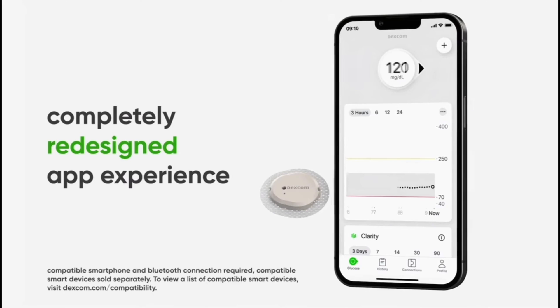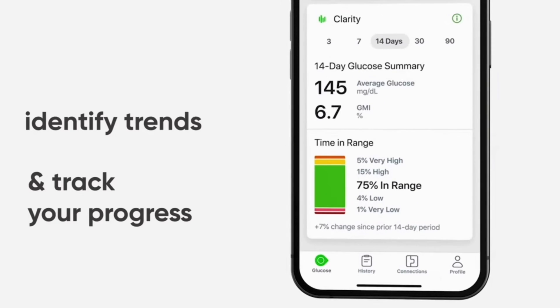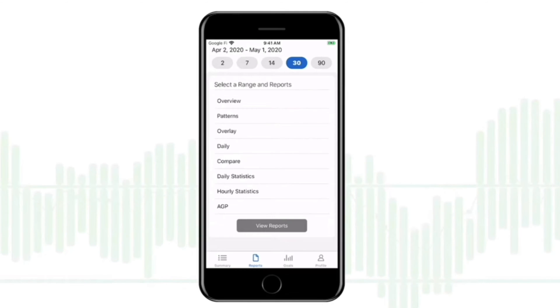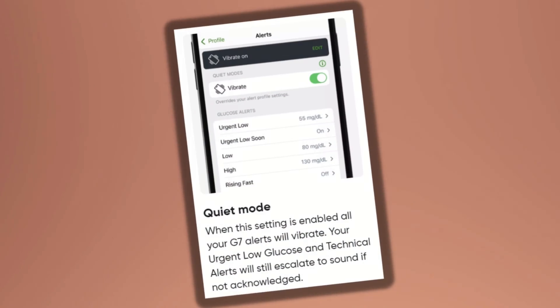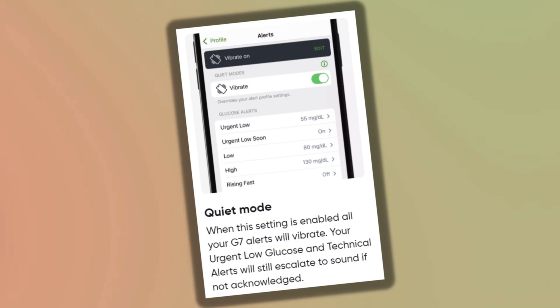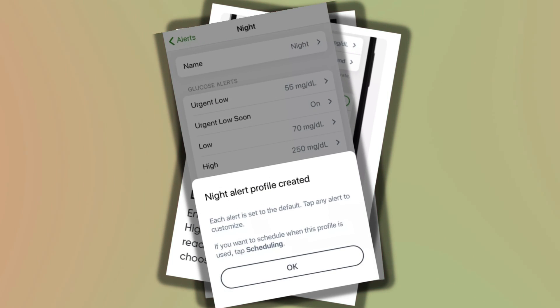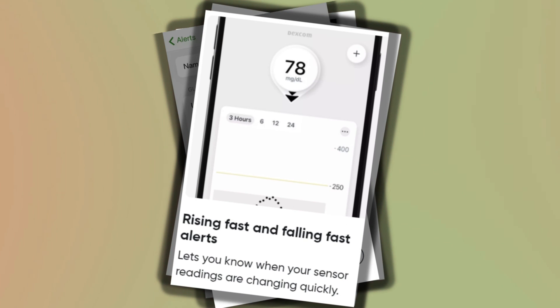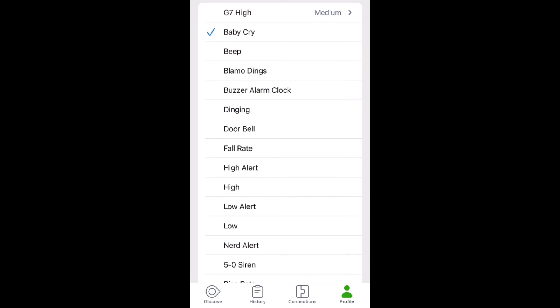This is one area where the Libre 3 software is lacking, and where the Dexcom G7 software really shines. The Dexcom G7 software is completely revamped. Clarity data is built right into the home screen, and you can access time in range as well as average glucose levels over set periods of time. A game changer is the alarms — you have quiet mode to silence all alarms for a set period, the ability to delay the first high alert, set different profiles for different times of the day, alarms for rapidly rising or dropping glucose levels, and tons of different alarm tone options, including my favorite — the baby cry.